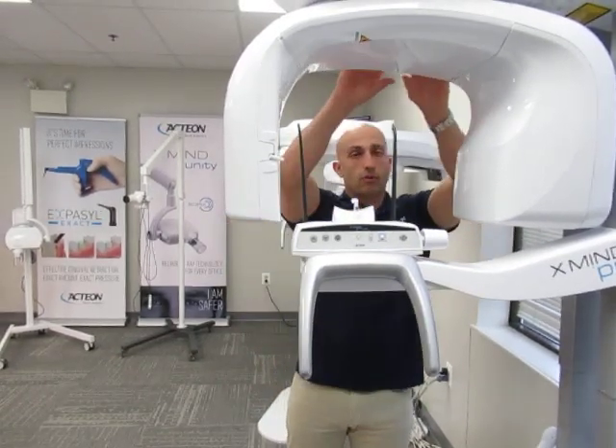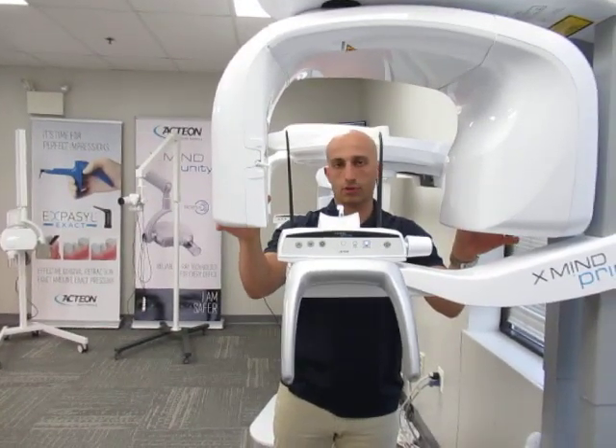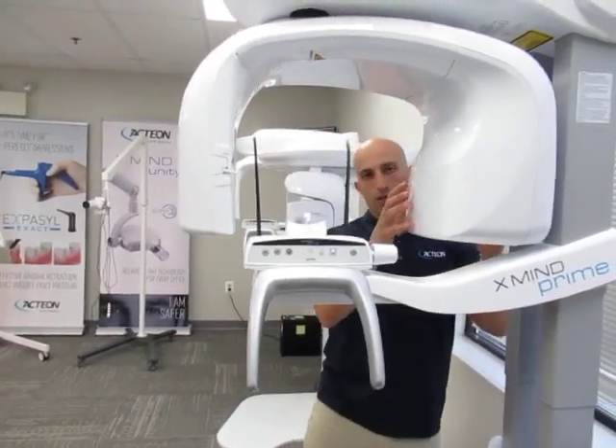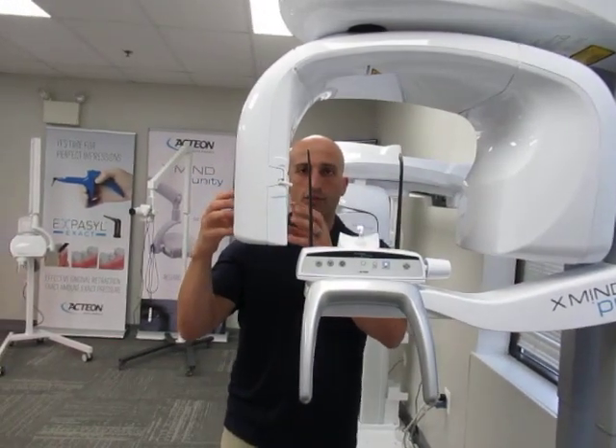This apparatus, which spins around the patient's head, is called the U-Arm. Some refer to it as a C-Arm. This fatter end here is the tube head, and the skinnier side here is the sensor.